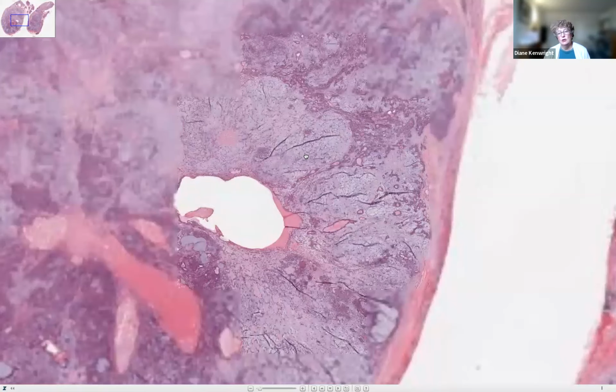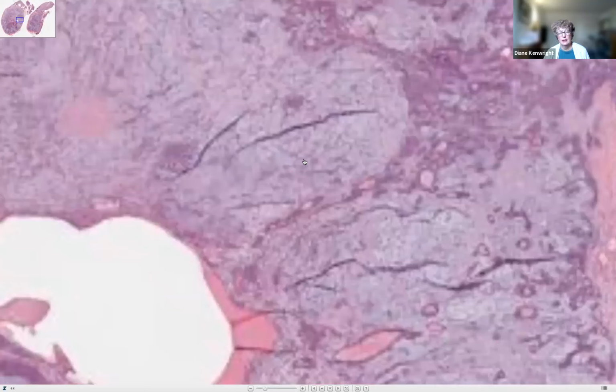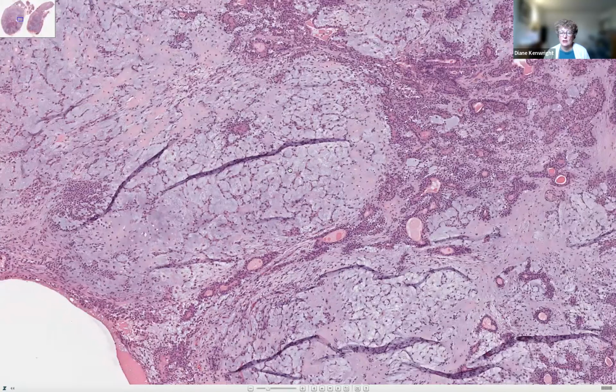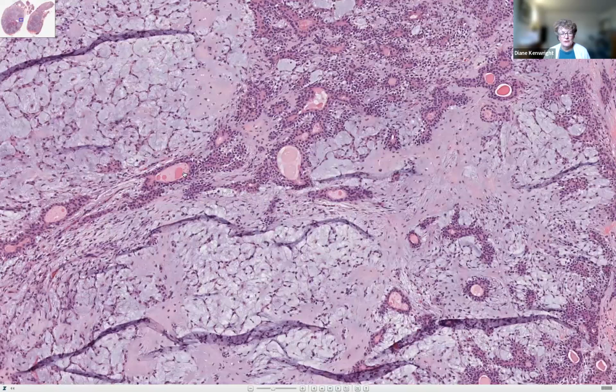And as we come in, you can see in the stroma are these cells that look like little octopuses. They're actually called stellate cells, but you've got to imagine stars drawn like the old-fashioned star, with the kind of things going out. So they don't look like flaming balls of hot gas. They've got very spindly extensions. And when we look here, we can see that we've got ducts and they've got pink stuff in them. Pink secretions.